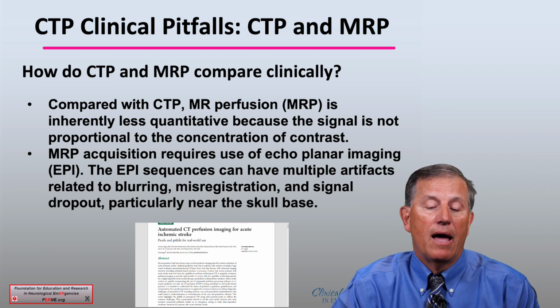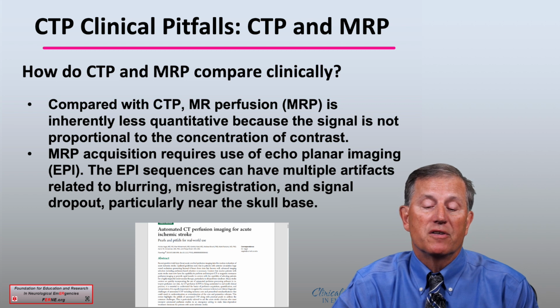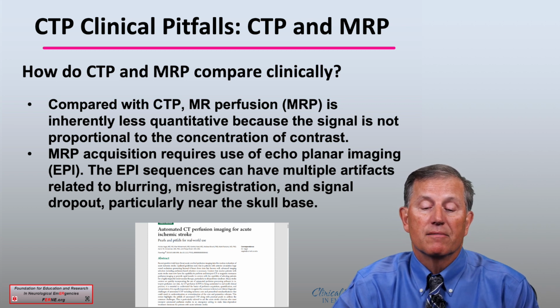And we know that MRP requires the use of echoplanar imaging, which can have multiple artifacts because of blurring, misregistration, or signal dropout, especially near the skull base.